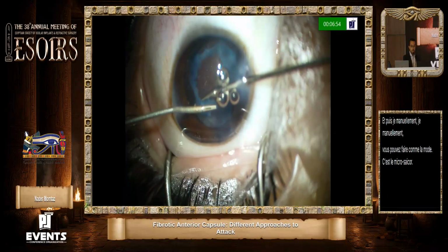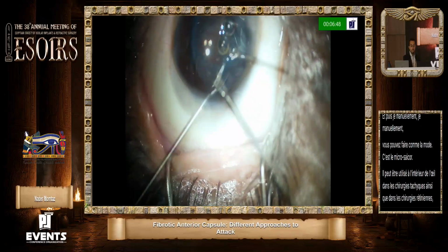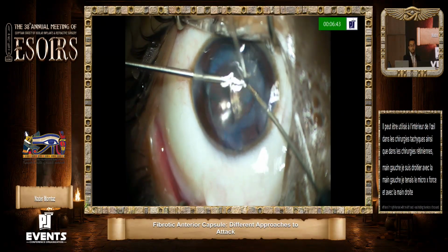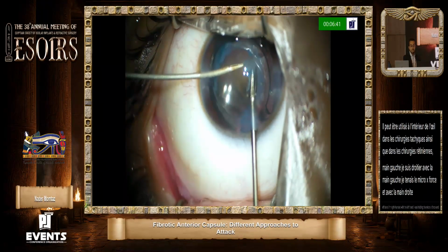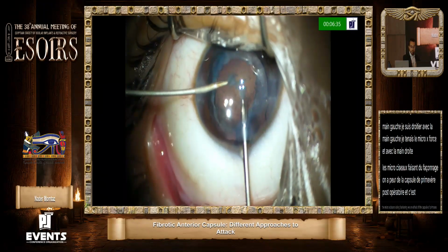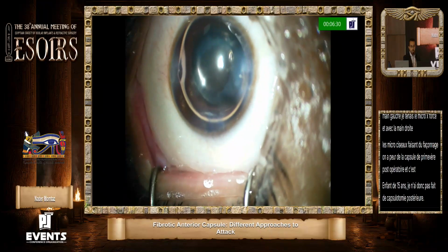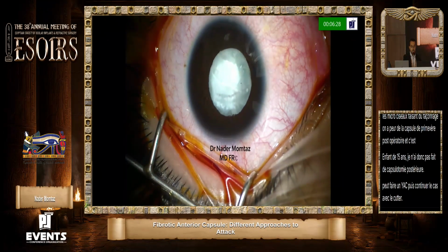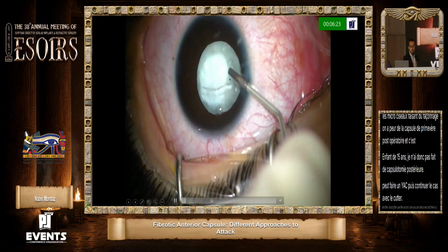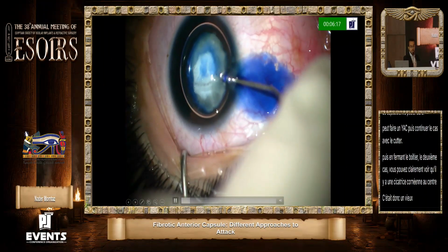With the left hand, I'm right-handed. With the left hand, I was holding the microrhexis forceps, and with the right hand, the micro scissors doing fashioning. We're afraid of the capsular phimosis postoperatively, and this is a 15-year-old child, so I did not do posterior capsulotomy. You can do a YAG, and then continuing the case with the cutter, and then closing the case. The second case, you can clearly see that there is a corneal scar centrally. So that was an old presentation, delayed presentation of traumatic cataract.